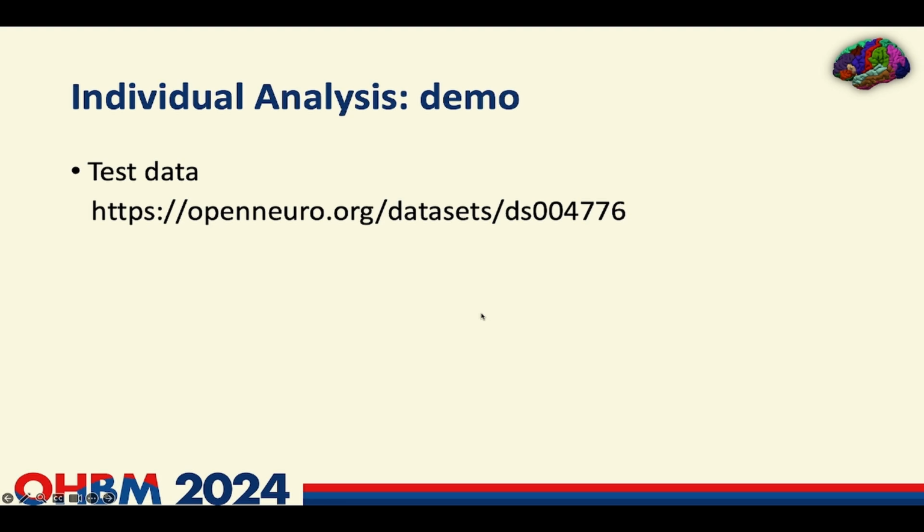Make sure you know what the input is. Make sure that you check the surface labels, the volumetric labels, or whatever it is that you are going to be working on, because that's very important, right? If you don't check and there are errors or mistakes, and you don't notice that, then all your analysis is going to be comparing erroneous measurements to something that you don't know.